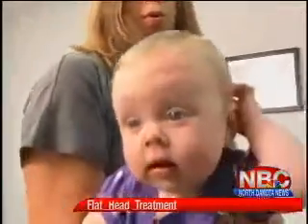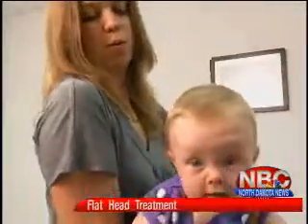Ivy needs the helmet to correct positional plagiocephaly, the flat head condition she was born with.